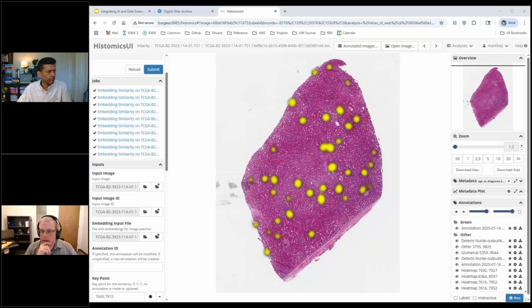Yeah, and to the last question I see there, yes, there are definitely limitations to converting to DICOM. We have used other people's tools for the most part to do this, because we're trying to leverage what already exists. And part of that is that there are literally hundreds of formats, with no consistency in how those formats store metadata. We've tried to standardize this in certain presentations. DICOM has very strict standards saying this is the tag for this field, and you'd be like, great, here's where patient age goes.